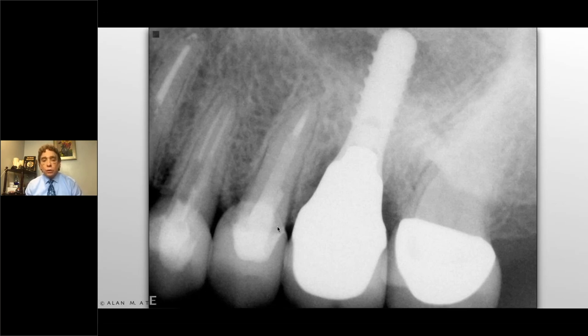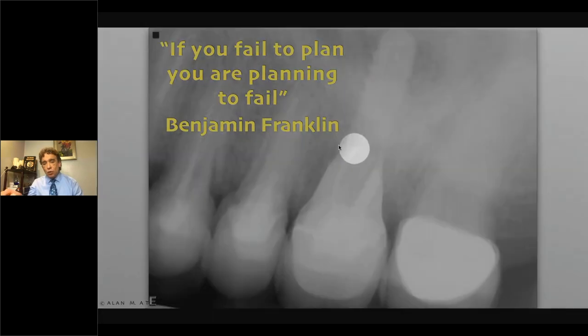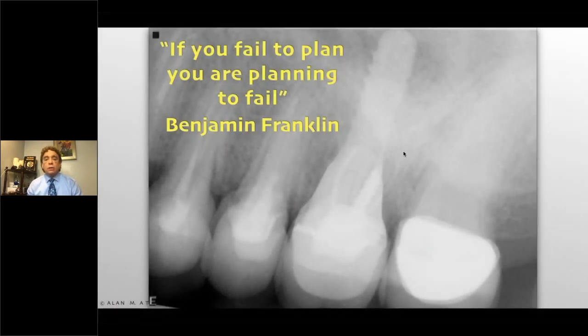Not only that, he took out the tooth and did an immediate implant, didn't graft the site first, didn't put in only bone graft. So if you look closely, the apices of the root are at the platform of the implant. How is the patient going to maintain and keep this clean? Nonetheless, the patient was happy with the tooth, but every time she came into my office, it upset me greatly.